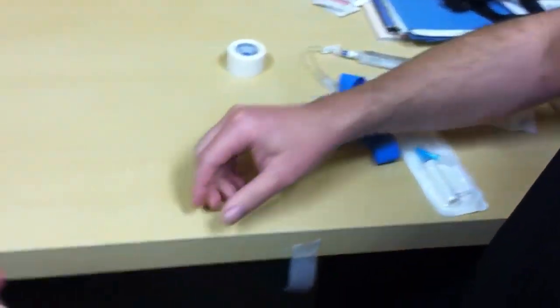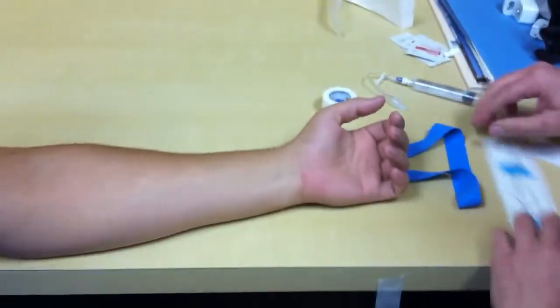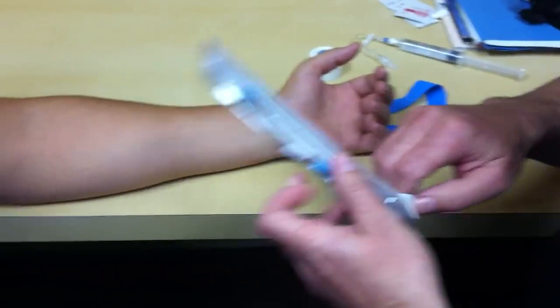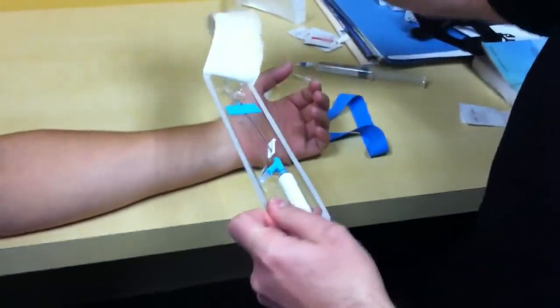Today we're going to show the students how to do an IV — not a needle injection, but an IV, intravenous line, otherwise known as a catheter.